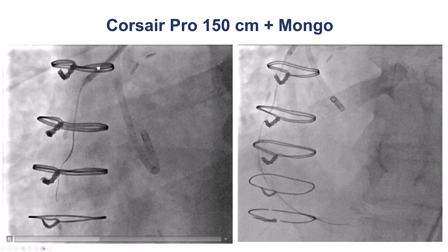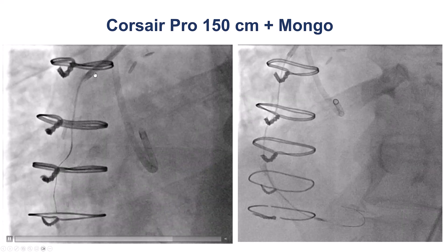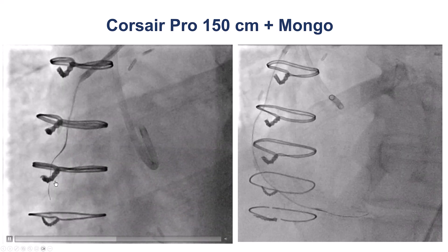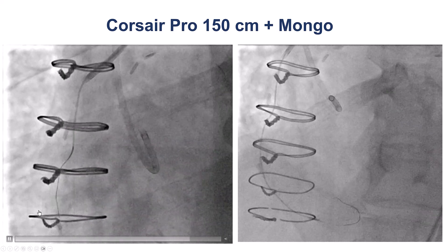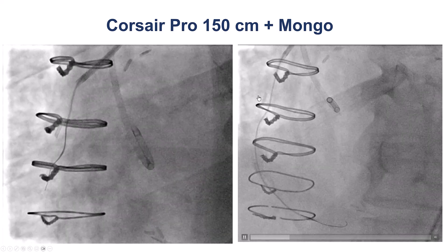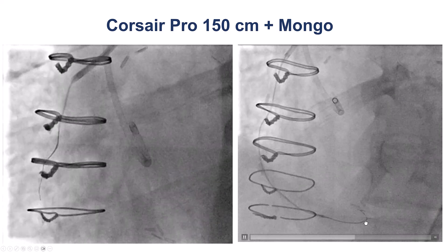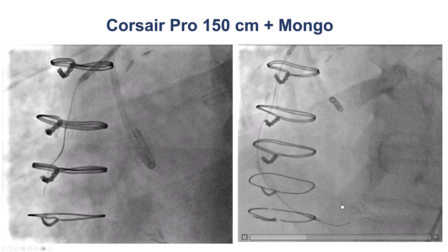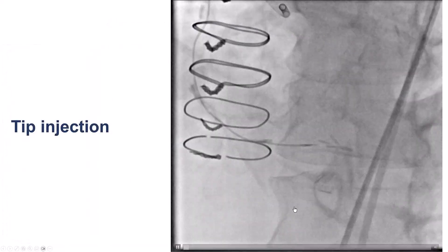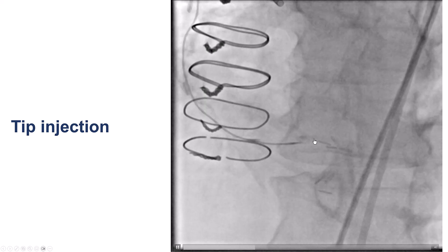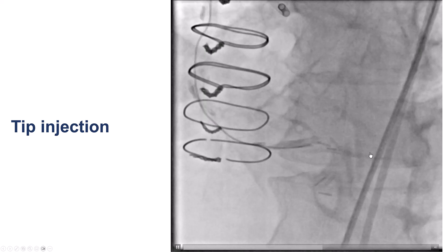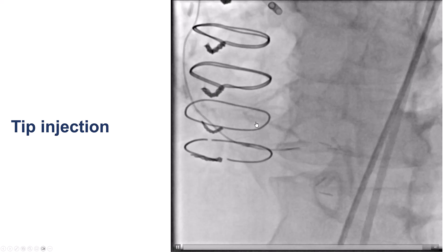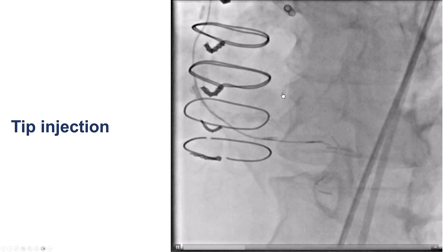We engaged the vein graft with a multipurpose guide. We used a Corsair Pro microcatheter and a Gladius Mongo wire, which is the standard setup for crossing occluded vein grafts. The Mongo actually went easily down to the PDA and then retrograde towards the distal right coronary artery. A tip injection after crossing the vein graft demonstrated the PDA and flow going all the way back to the bifurcation of the PDA and the posterolateral.